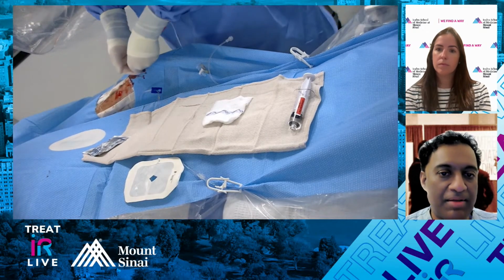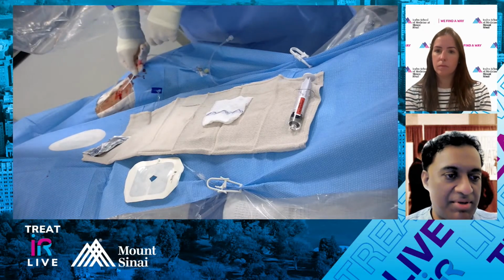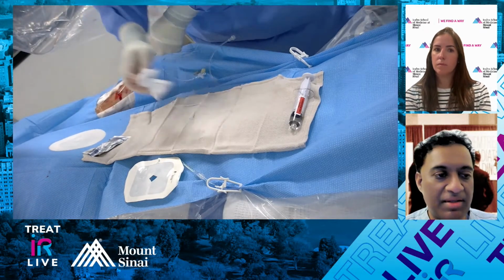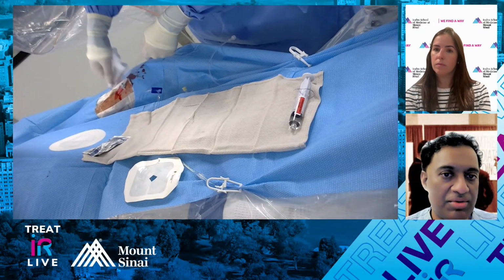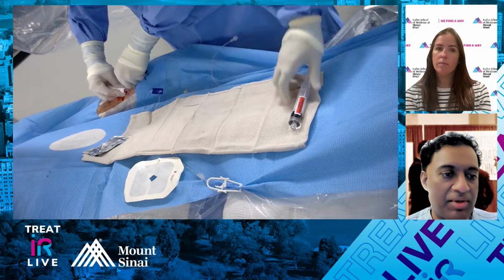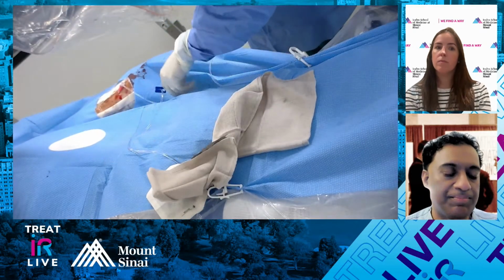They will probably have some buttock claudication, up to 40%. Pelvic ischemia is a possibility, but low likelihood. You did end with the IMA, but still, I don't think that will usually be an issue. And again, pretty well tolerated. I've even done staged bilateral hypogastric embo, so I think it's very reasonable.